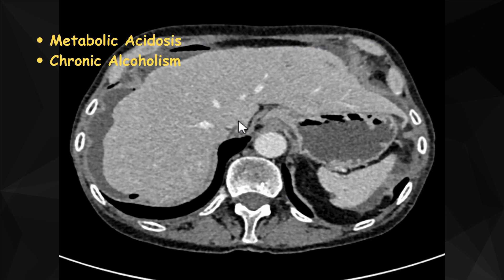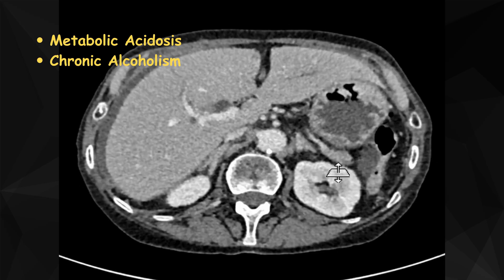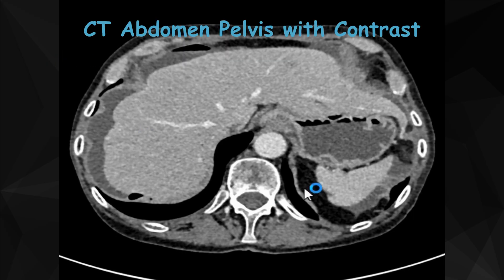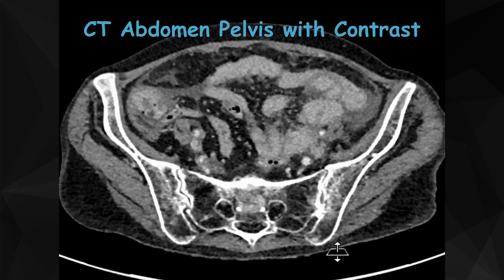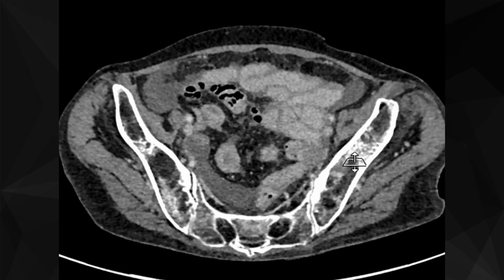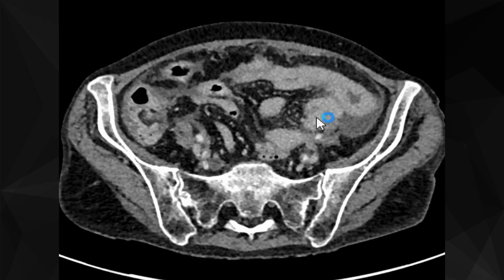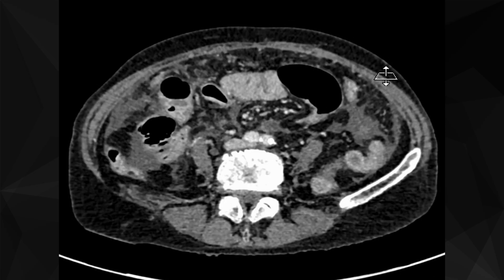metabolic acidosis on the background of chronic alcoholism. A CT scan of the abdomen and pelvis was performed with portal venous contrast. On this scan, you can see some free fluid around the liver. There is further free fluid in the central abdomen and also some in the pelvis. Look at the bowel loops.